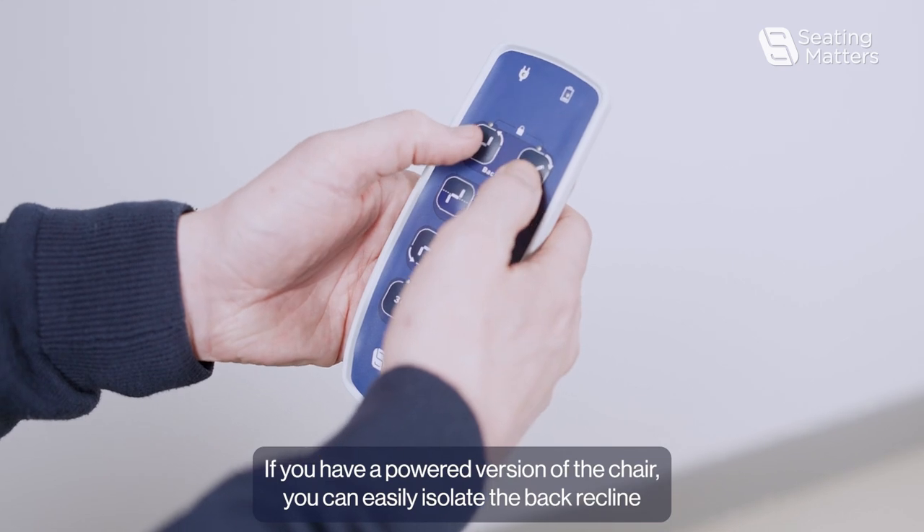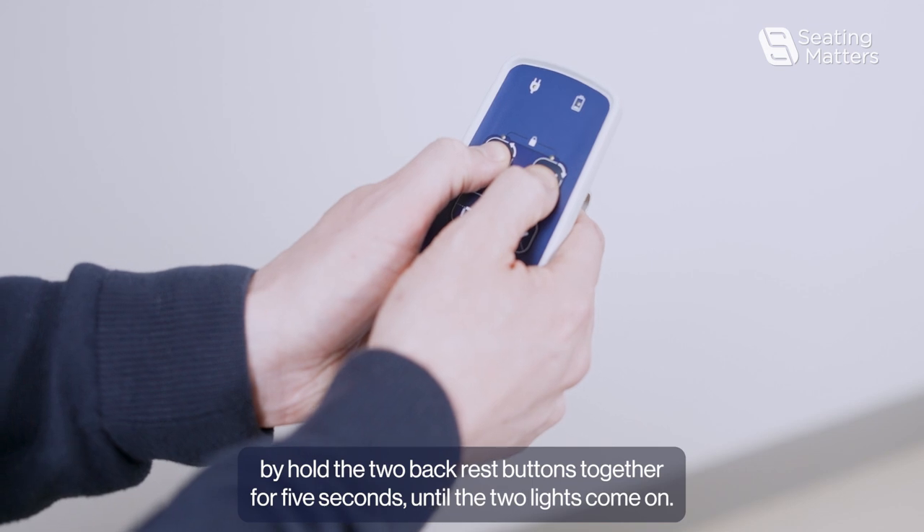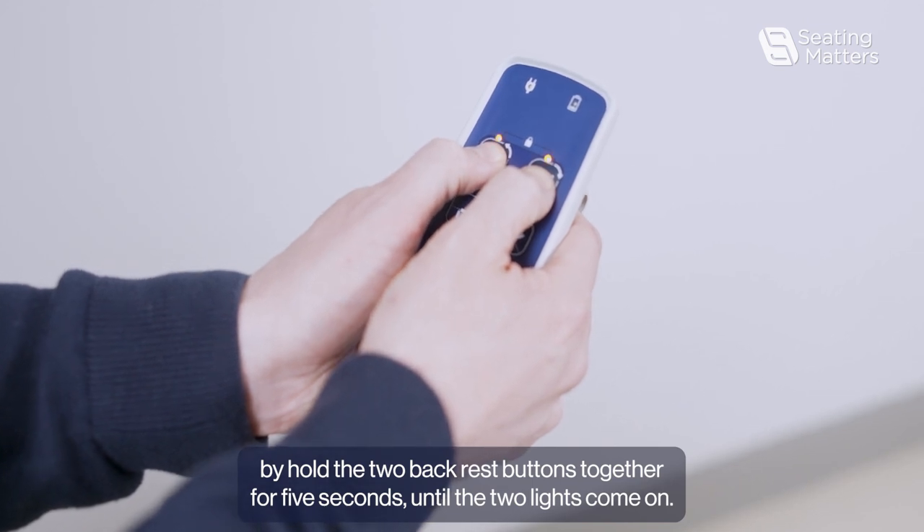If you have a powered version of the chair, you can easily isolate the back recline by holding the two backrest buttons together for five seconds until the two lights come on.